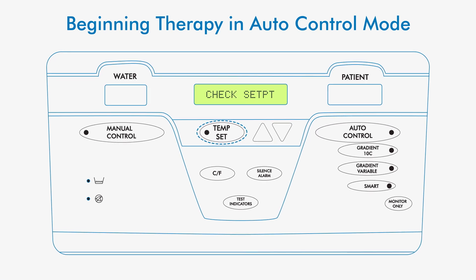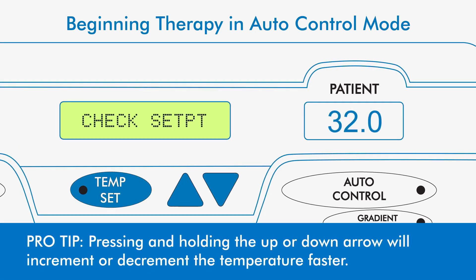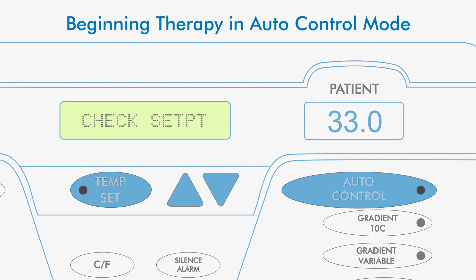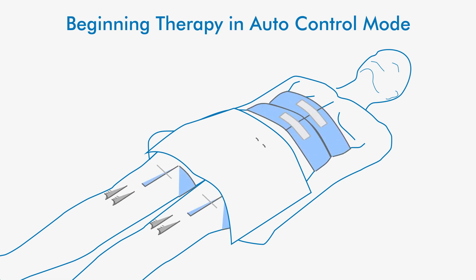Set the desired target temperature and begin therapy in auto control mode. Press the temp set button and use the up or down arrows to choose the target temperature, then press auto control. After pads fill with water, secure the pads around the patient with the Velcro straps.